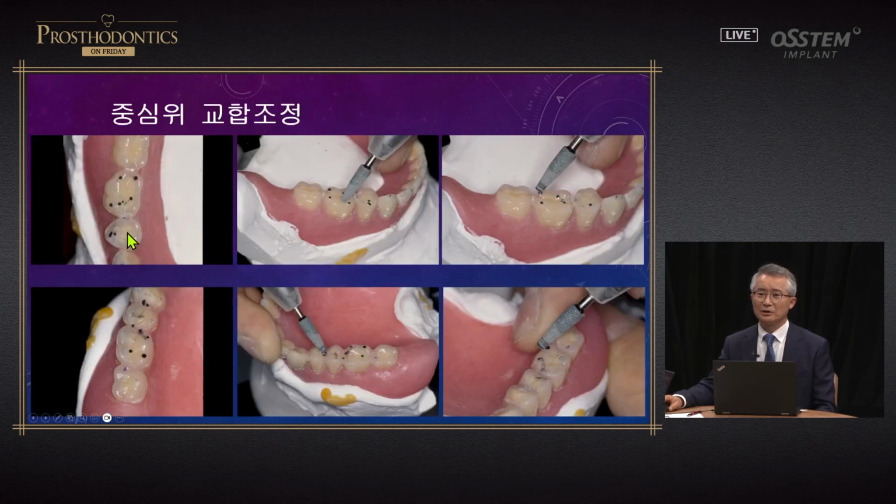You can see that it's marked here. We're reading this. Cusp tip bevel, we need to observe it closely and make necessary adjustments. You also need to check the antagonist area. This is cusp tip and bevel. Bevel needs to be removed with a ratio of 1 to 1. And we need to make calculations as we make adjustments.